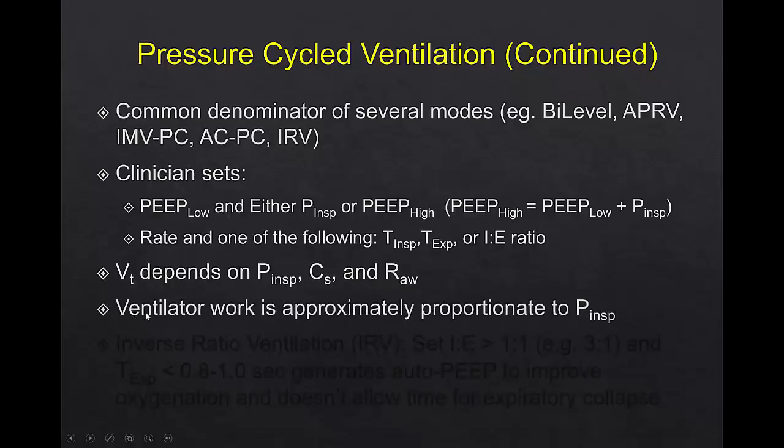Just like I said with pressure support, the ventilator work is approximately proportionate to the amount of inspiratory pressure. Not exact, but it's a good approximation.